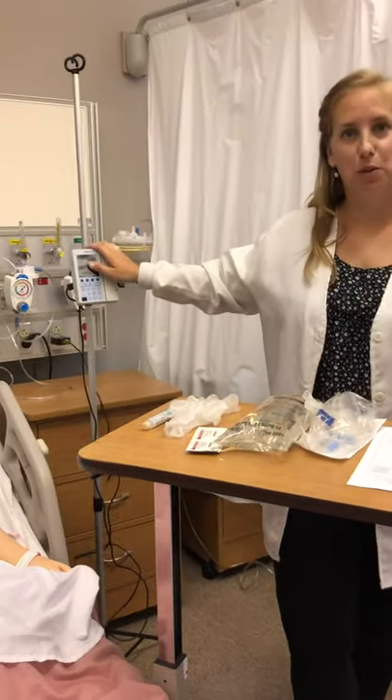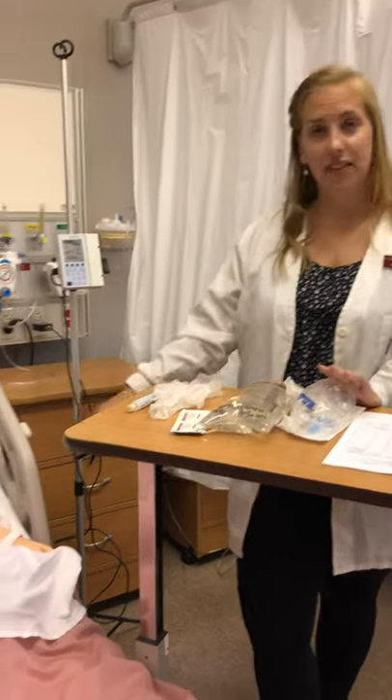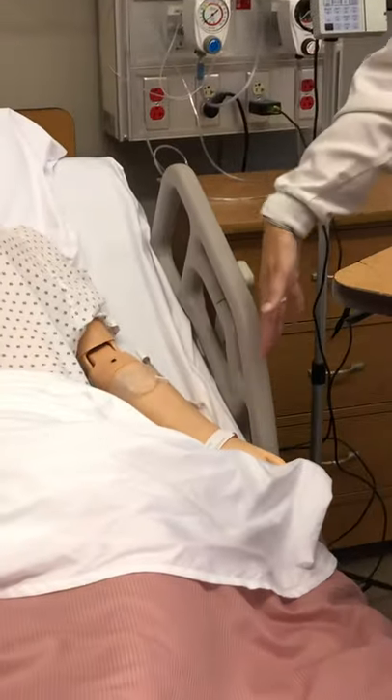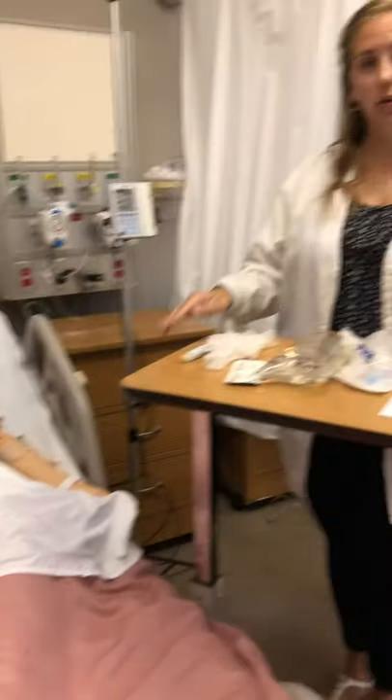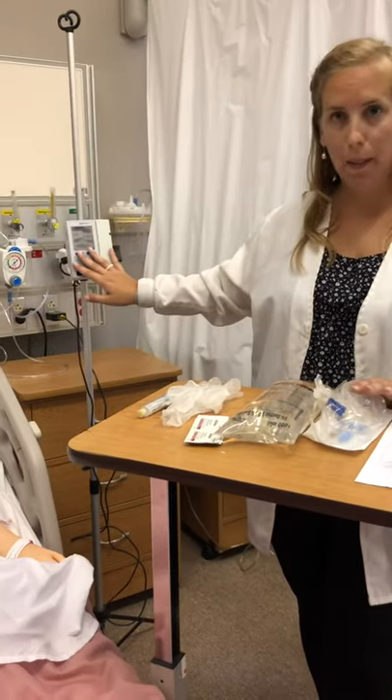Hi everyone! This will be a brief demonstration of how to use a Baxter pump. We have a previous video on how to assess an IV site, what to look for when caring for an IV, and how to use an Alaris pump. For that information, refer to that other video. This will be specifically about the Baxter pump.